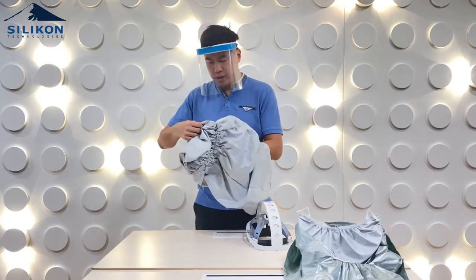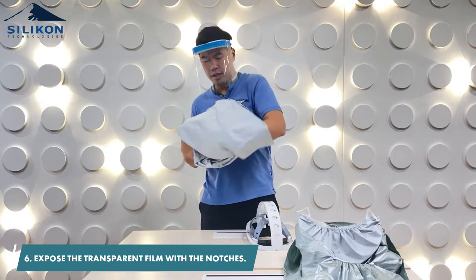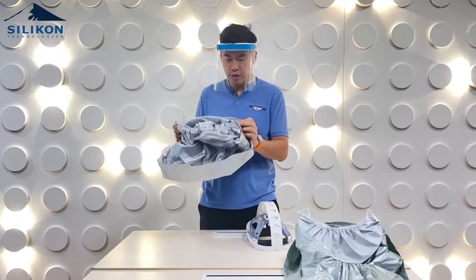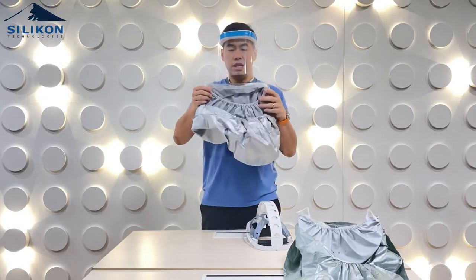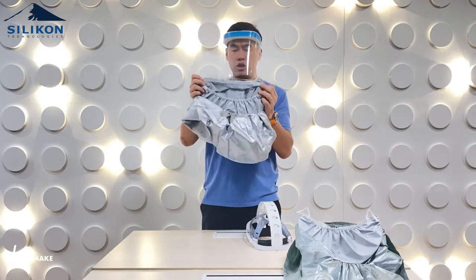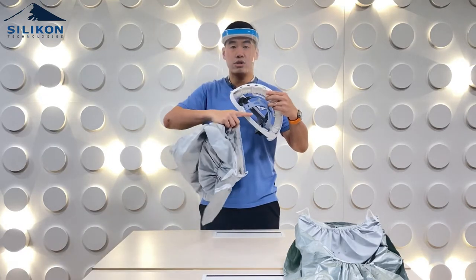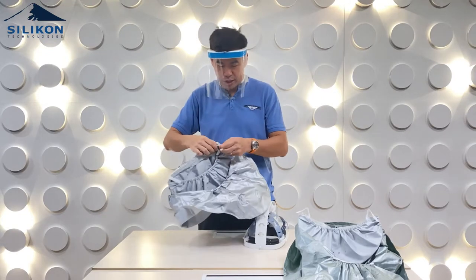With the new hood, the first thing you have to do is expose the transparent film inside with the three notches. You have to align it — that's the first step. You have three notches on the hood that need to be aligned to the three holes on the hood frame. Start from one side.